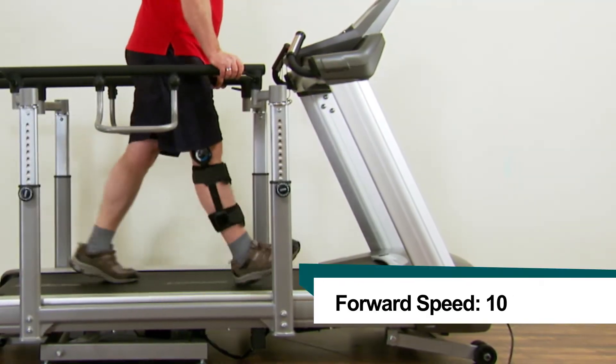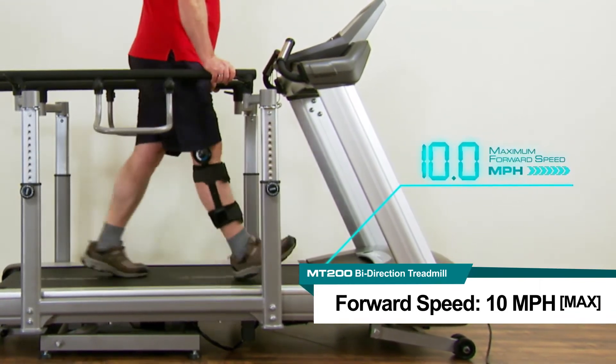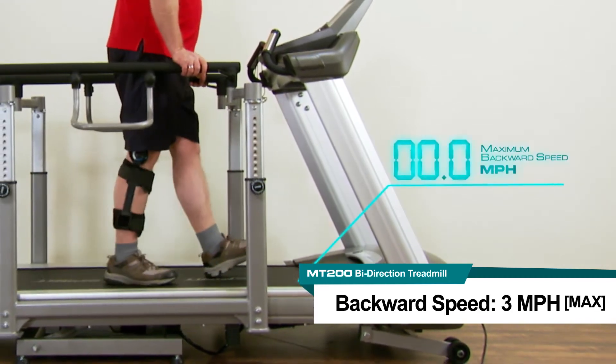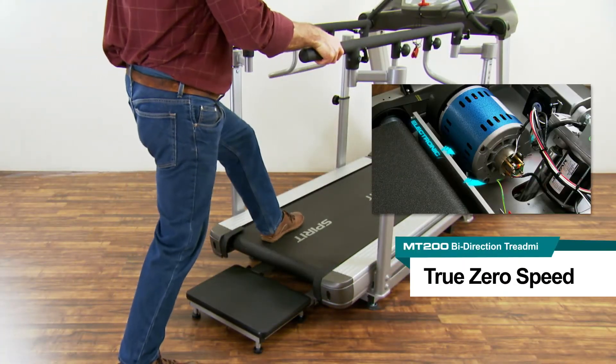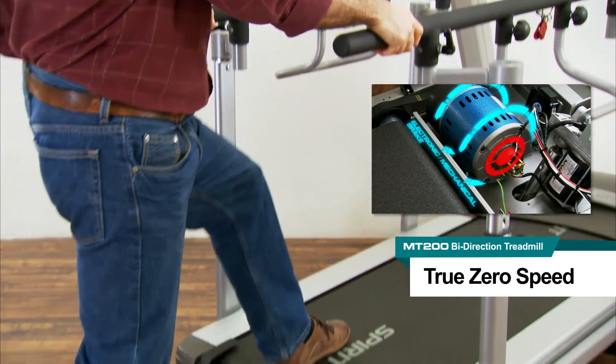The MT200 treadmill has a low 0.1 mile an hour starting speed with 0.1 mile an hour speed increments. The maximum forward speed of 10 miles an hour, all the way to the maximum backward speed of 3 miles an hour, means that the variety of speed changes can be used by injured patients all the way up to athletic conditioning.